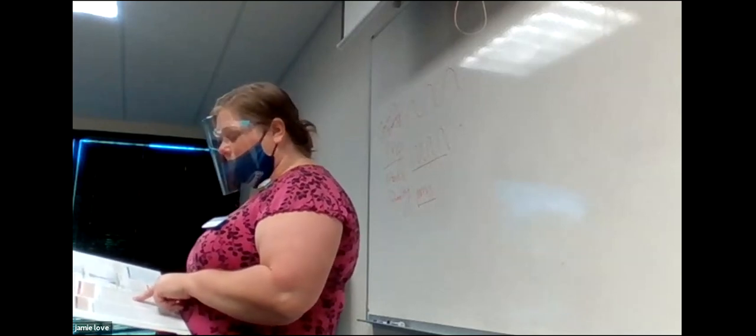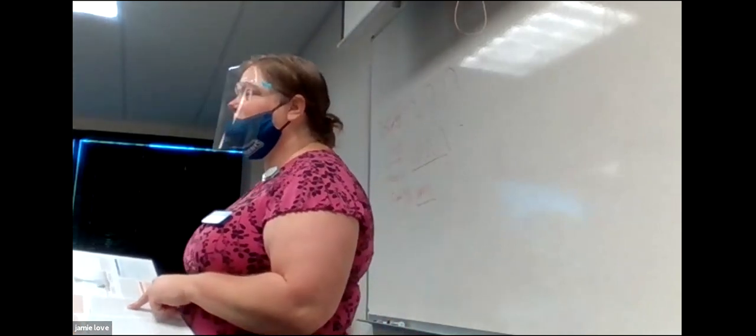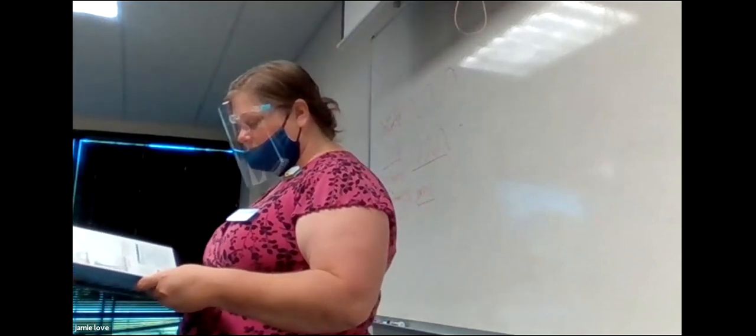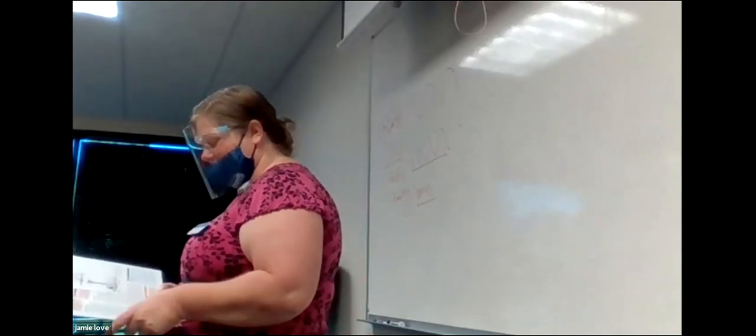That's the inverse square law. Quantity of X-rays changes by the square of the distance when we're talking about distance and KVP. Is this just saying we need to know the inverse square law? No, this is a whole different formula. This is called the 15% rule. The inverse square law is what we learned yesterday. So this is a different formula we're going to talk about. Beam quantity is going to change by KVP. If we double KVP, the intensity is going to go up by 4. So you don't need to worry about that part. You need to know this 15% rule part, the next part.